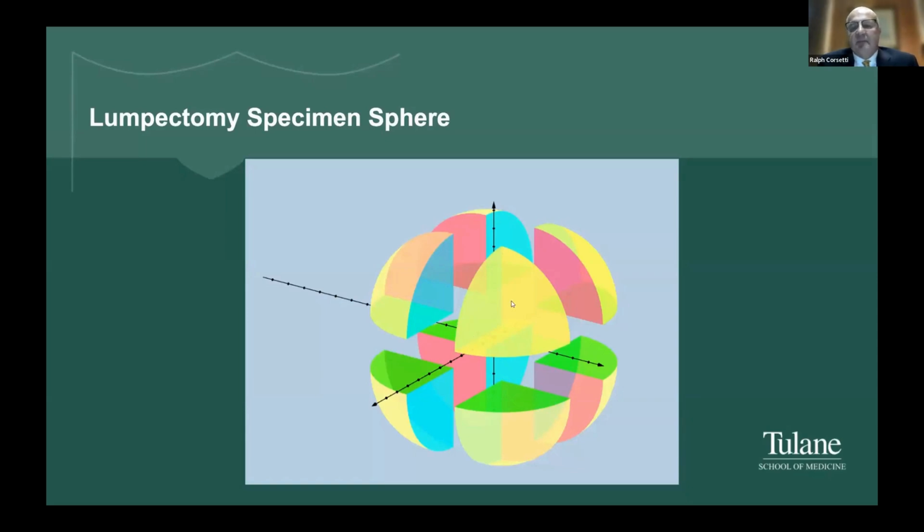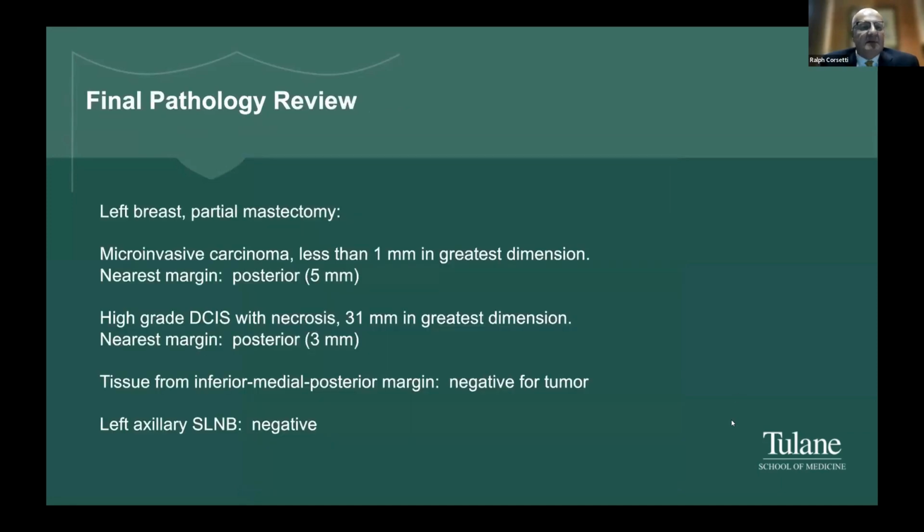So a hemiquadrant or 1/8 of a margin. And so by doing this, I'm taking 75% less of what I used to take. If I had had a prior re-excision required on a lumpectomy specimen, and if I had a positive margin, I'd take the patient back to surgery. And if they told me the medial margin was positive, I wouldn't know if it was the anterior medial, the posterior medial, the superior medial, or inferior medial. There's different parts of that medial margin. So by doing 3-dimensionally, you can really take less tissue out.